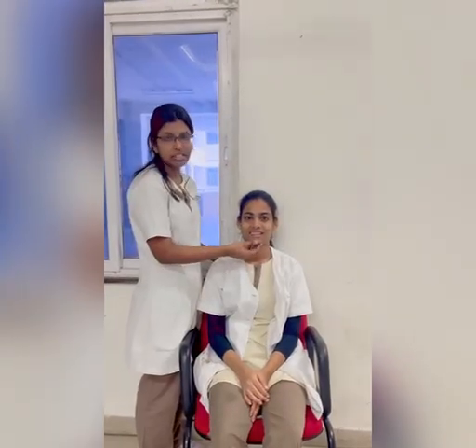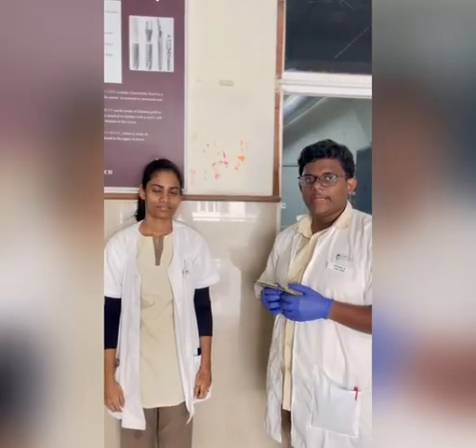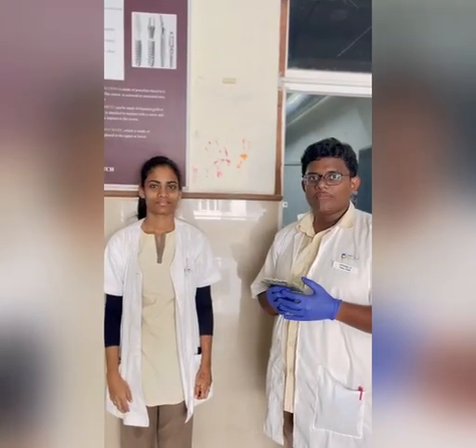Now we are going to see about shade selection guidelines. First, the walls and cabinets should be in pastel or light colors. Shade should be matched at the beginning of the appointment because the teeth will become dehydrated and the operator's eyes will become fatigued. Distractions like heavy jewelry or makeup should be removed. Teeth should be free of stains and plaque. The shade selection should be done in natural light with a viewing distance of 10 inches from the patient's teeth.